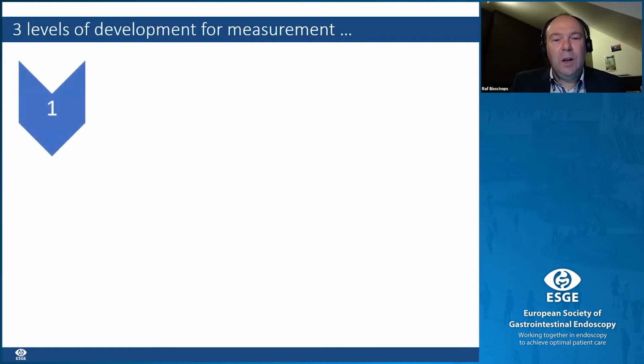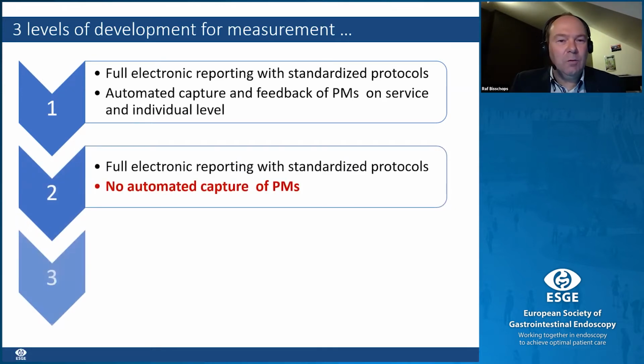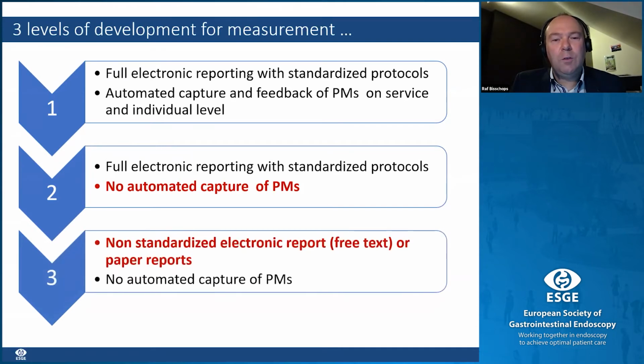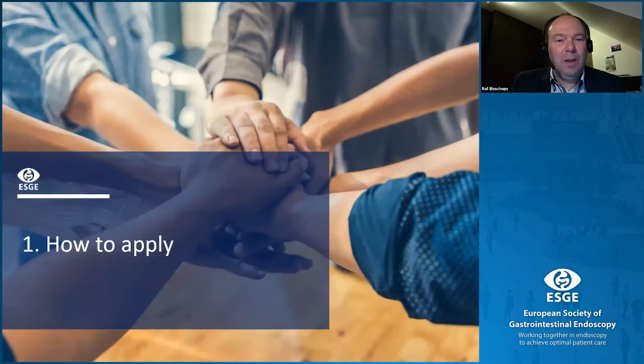So if you're using an electronic reporting system that automatically extracts all the quality indicators, well, you may not want to use the app as such. However, if you're using electronic reporting systems without automated extraction of the quality indicators, or if you use free text entry or paper reports, in that case, the app can definitely help you to assess quality.